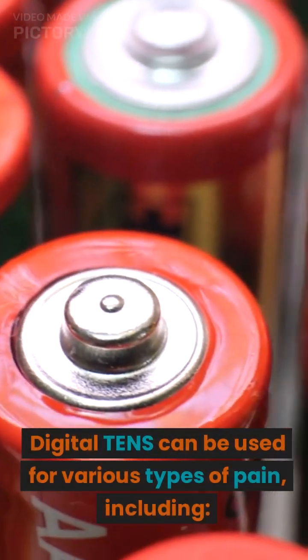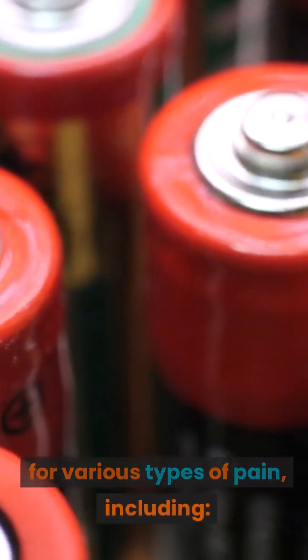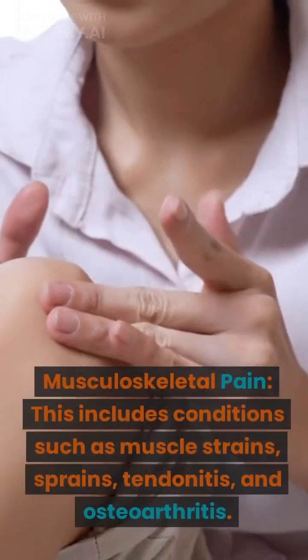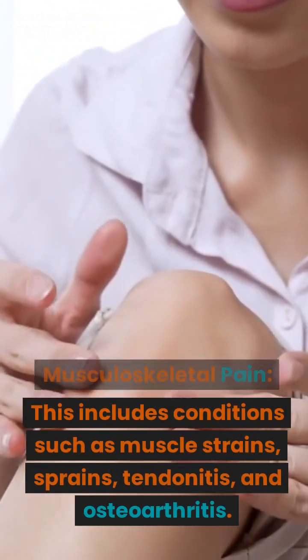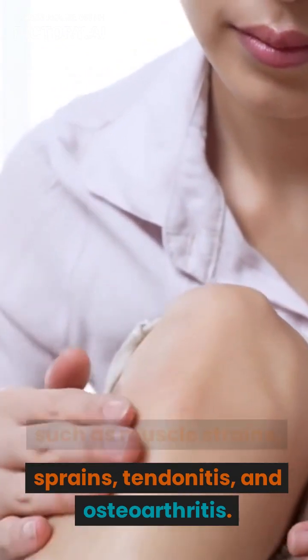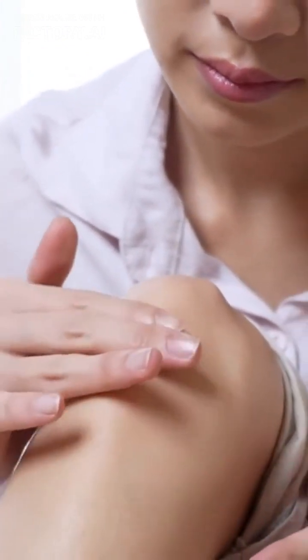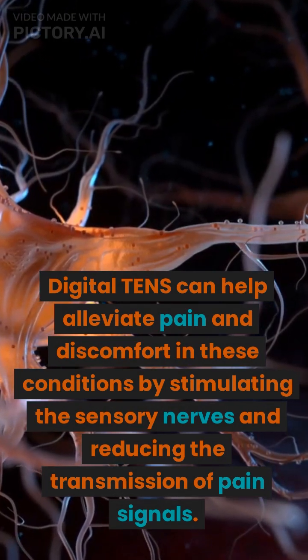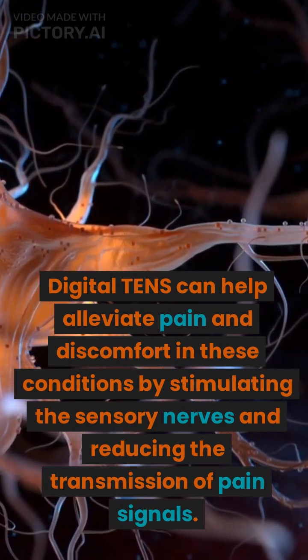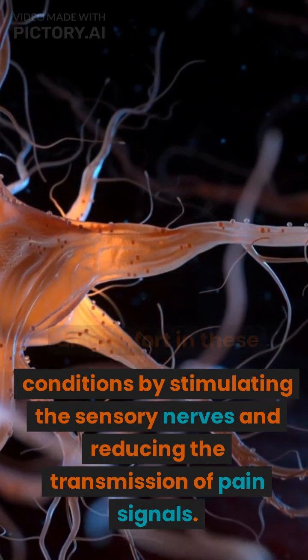Digital TENS can be used for various types of pain, including musculoskeletal pain. This includes conditions such as muscle strains, sprains, tendinitis, and osteoarthritis. Digital TENS can help alleviate pain and discomfort in these conditions by stimulating the sensory nerves and reducing the transmission of pain signals.